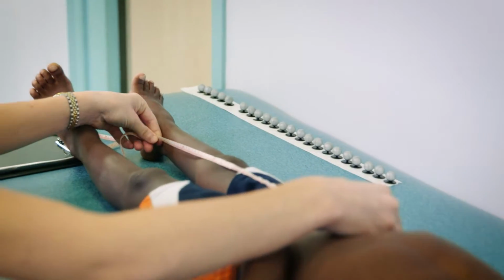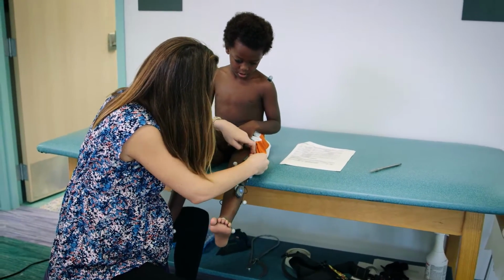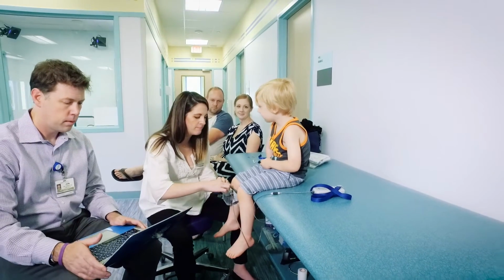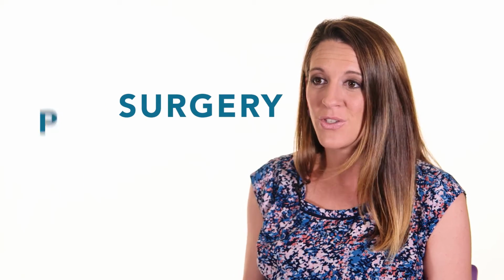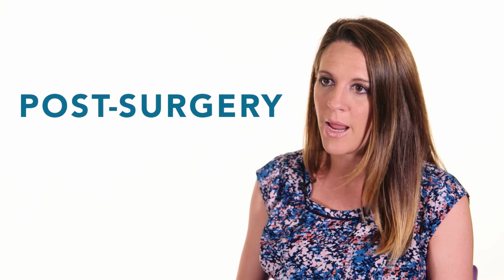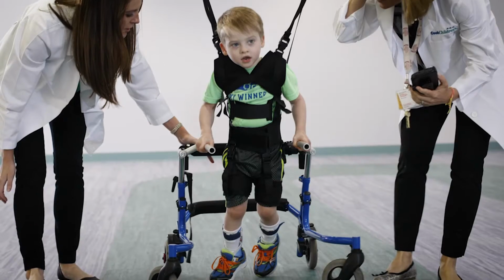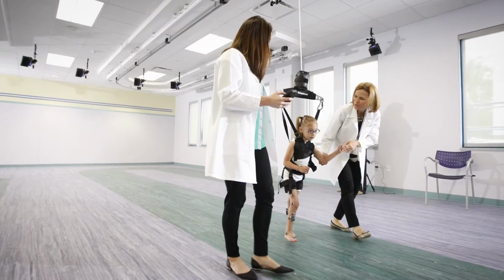We are also considering children with a diagnosis of muscular dystrophy, hereditary spastic paraplegia, children with dystonia. We've been fortunate enough to study some of these children prior to any kind of surgical intervention, have them have the surgery, and then return to us so that we can objectively measure the improvements that were made by those certain interventions. We have been evaluating children pre and post-surgical interventions such as a deep brain stimulator. It will add greatly to the literature on the deep brain stimulator, as well as the capabilities of what we can do in a motion analysis lab.